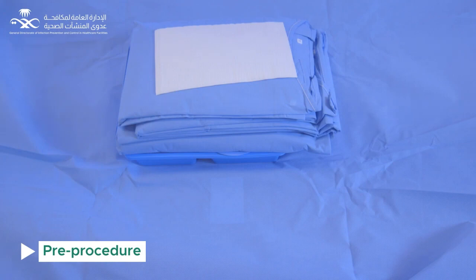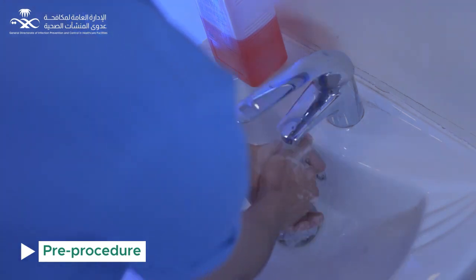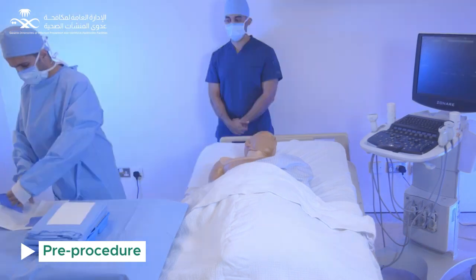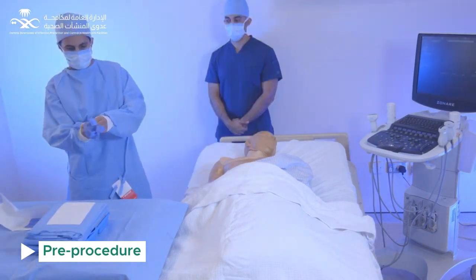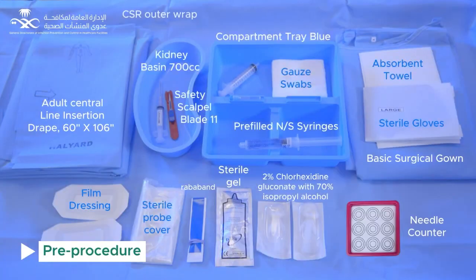Afterwards, disinfect the trolley with approved surface disinfectant. Wear head cap and face mask. Perform hand hygiene by washing hands with antimicrobial soap and water. Using an absorbent towel, wear surgical gown with the help of the nurse's assistant, and wear gloves. Set up sterile trolley and make sure all required items are prepared.